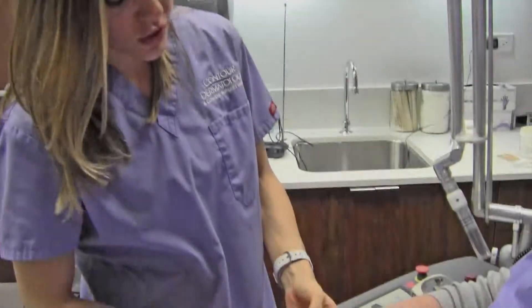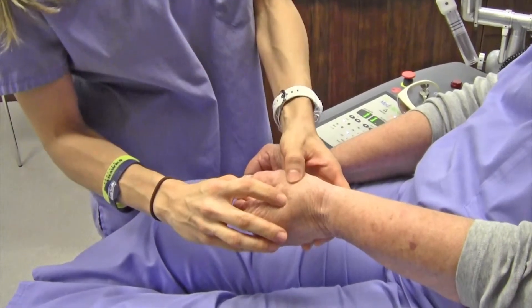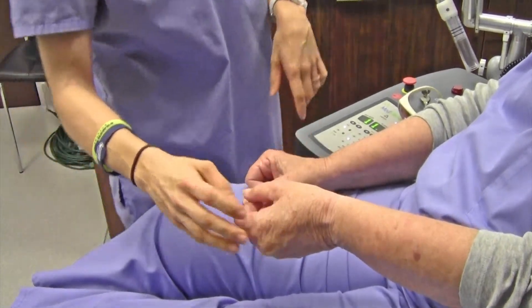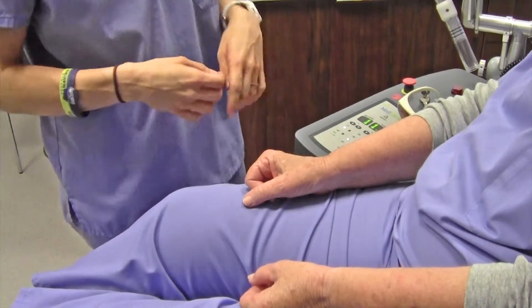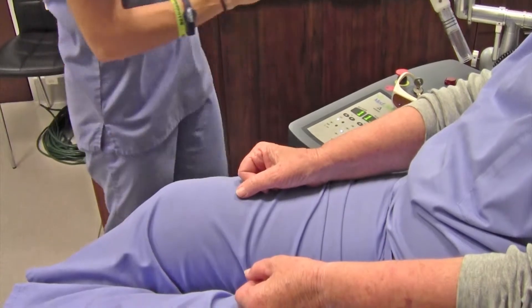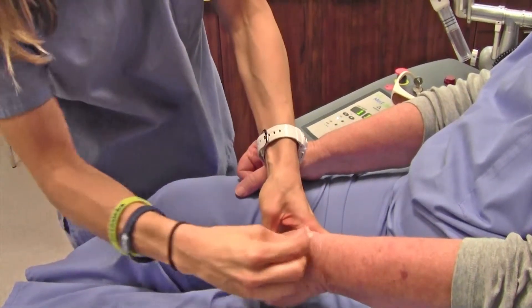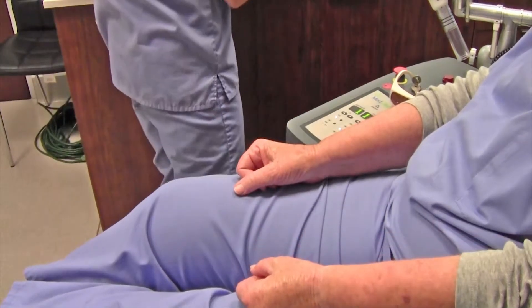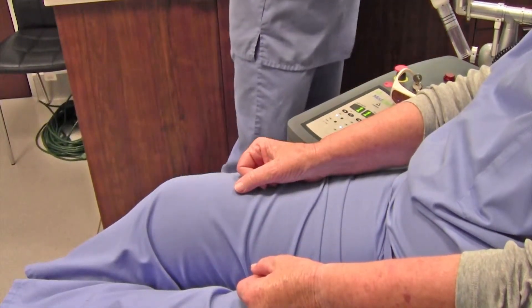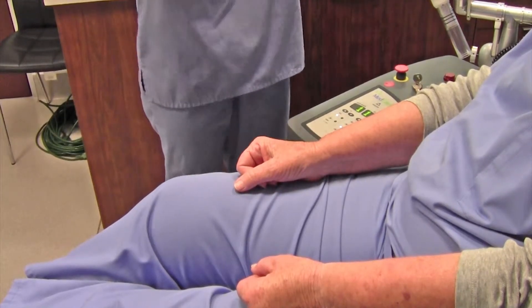So now we're going to do a demonstration. The first one is just right here on her hand, and then the second one we're going to do is on the other hand — very similar, most commonly called sunspots. So first, we're just going to clean the area. And then it's very important that we all wear safety goggles.